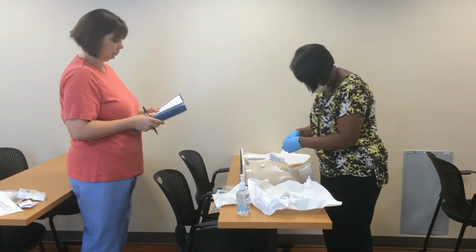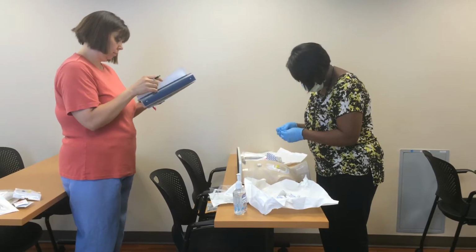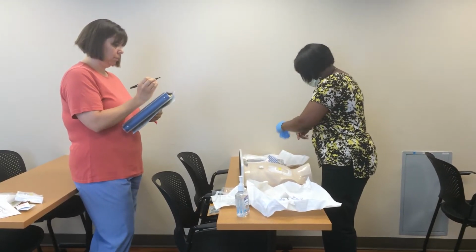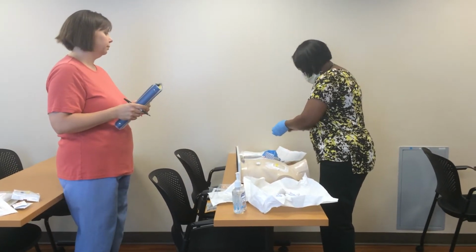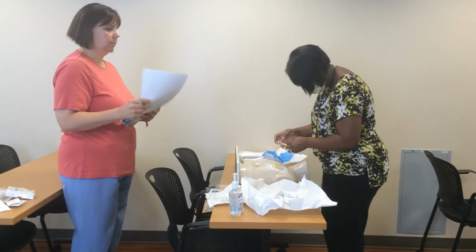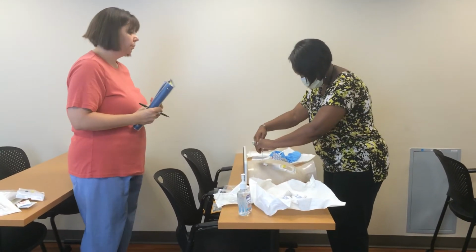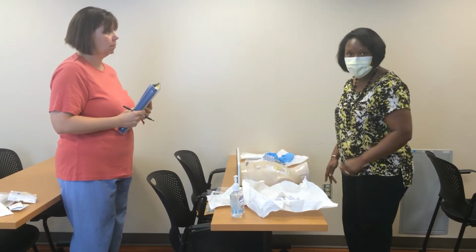Date and time. Okay, I think we're all set. Get that chemo started for you.